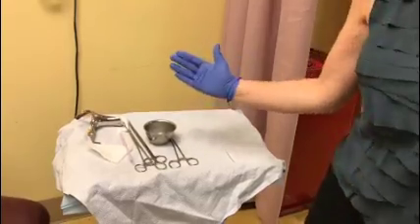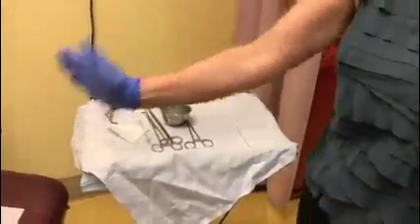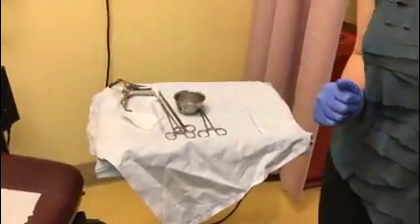So now I have the tray set up — all the handles are facing me as I face the patient, clean side towards the patient, sterile side distal to the patient.